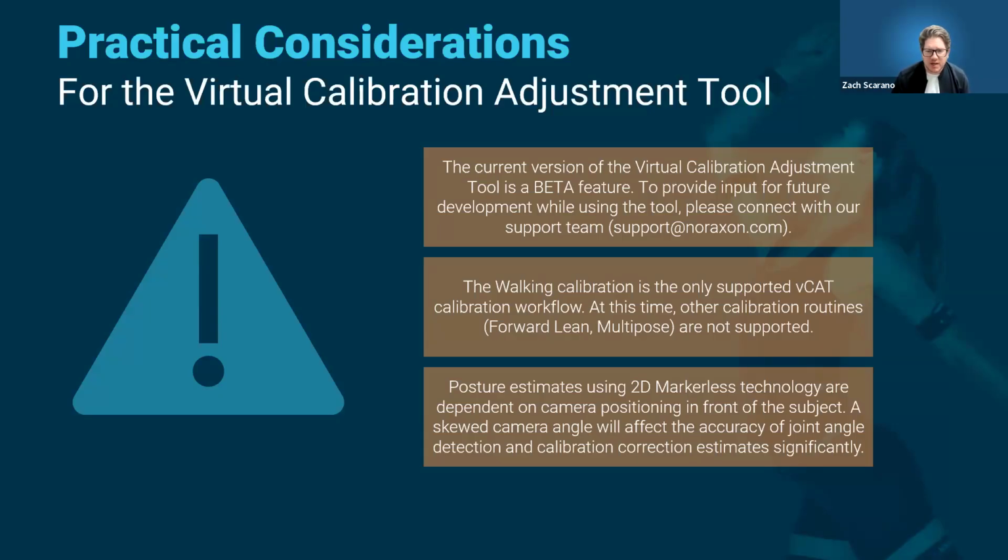and user experience improvements. And secondly, the VCAT calibration workflow is currently only available with the walking calibration. So the other calibration routines like forward lean and the multi-pose calibration do not yet have this workflow embedded, but they will be delivered soon.